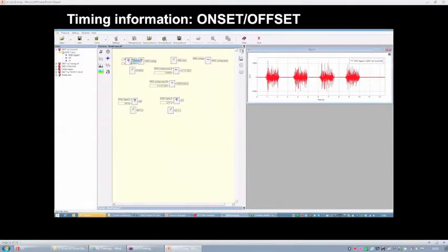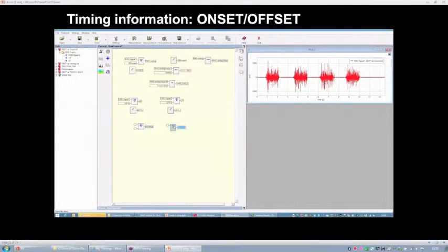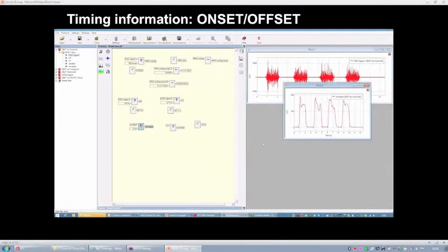And now I'm going to compute the envelope. It is typical, prior to computing the envelope, to perform filtering with a high-pass filter to remove the low frequency noise, and then to remove the high frequency noise with a low-pass filter. Remember that prior to computing the envelope, we have to rectify the signal. And now we are going to define the envelope frequency, so 3 Hz, and this is the result.